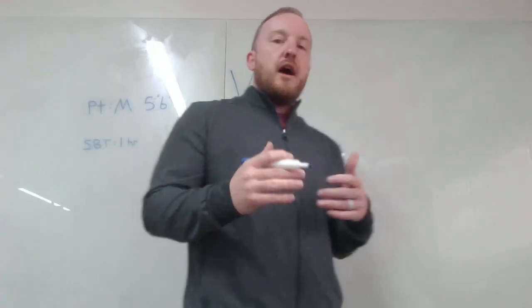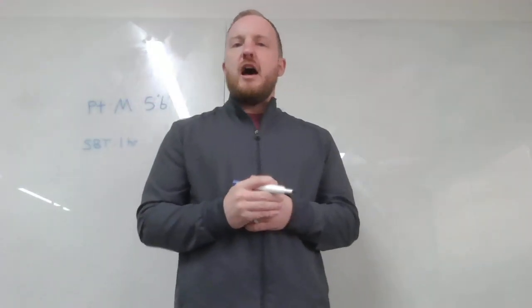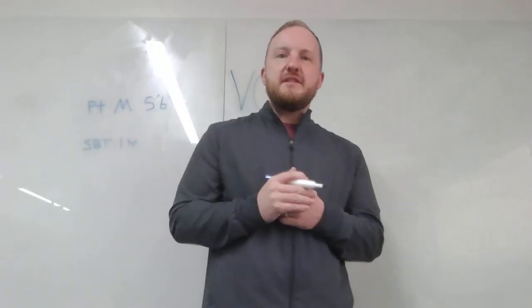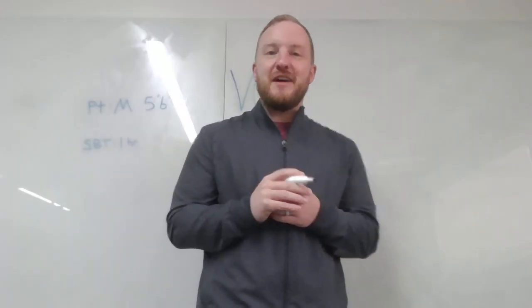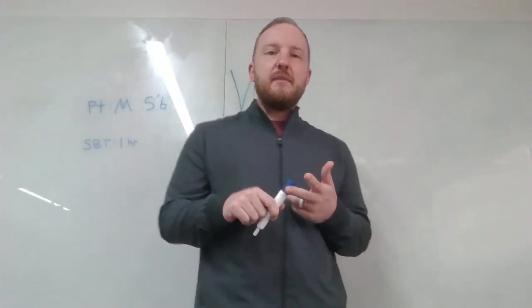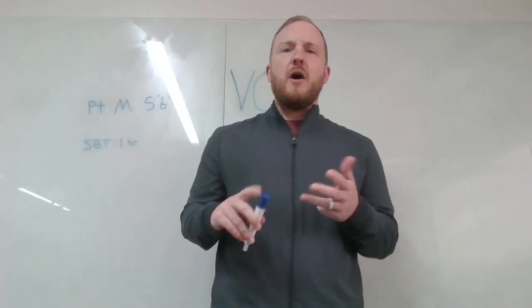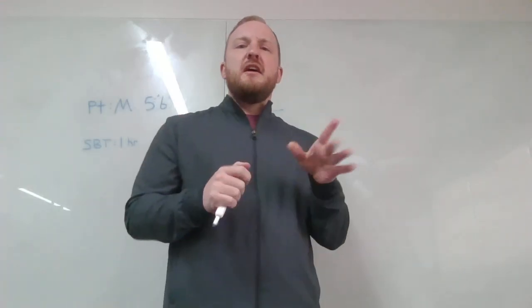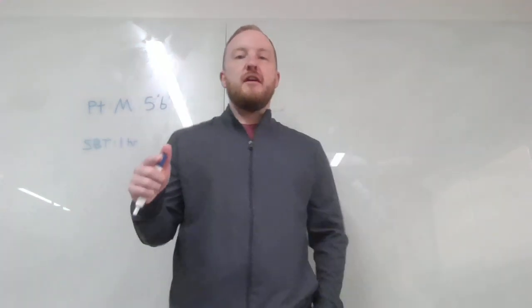Okay, so you're going to come across a scenario in the test, and it's going to say patient's been on a ventilator. Hopefully, the initial reason that they got put on the ventilator is resolved, right? That's the first thing we like to do, right? Make sure that we're hemodynamically stable. We want to make sure that we're not requiring high amounts of oxygen, and the doctor wants your opinion on whether or not they're ready to be liberated from the ventilator.